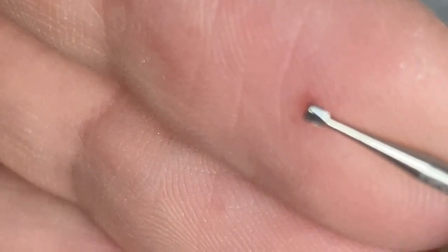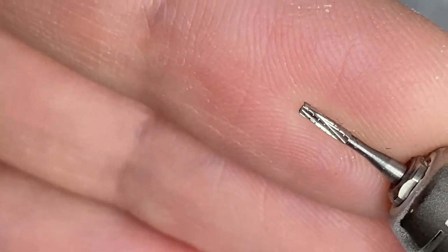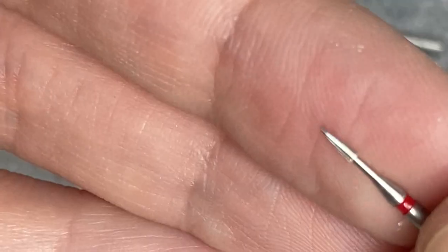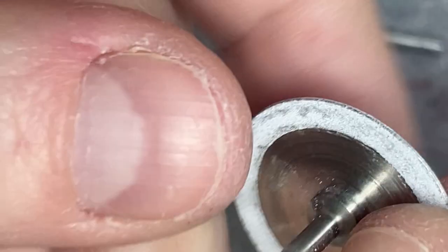But if you don't have that, you can use a regular burr number 37, like this one. The longer one is better, but either one is good. You can make your own needle burr from it.